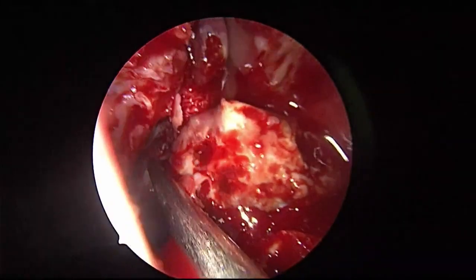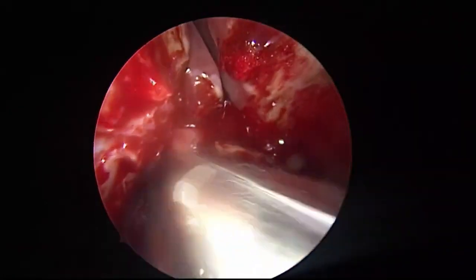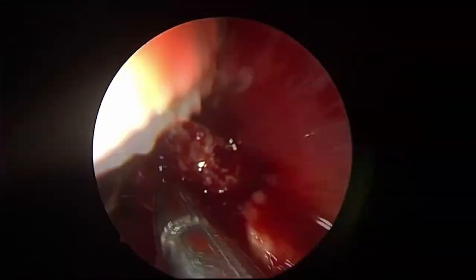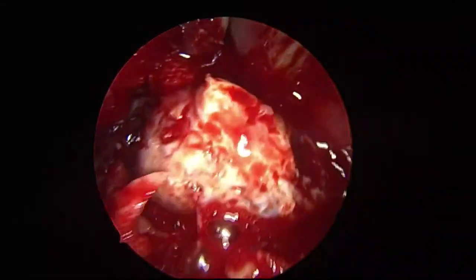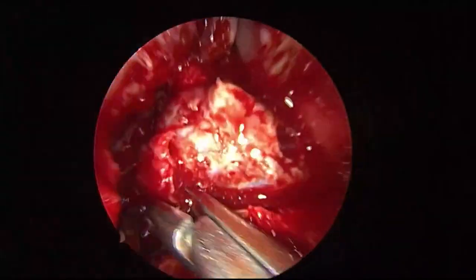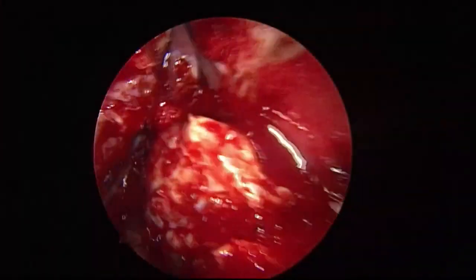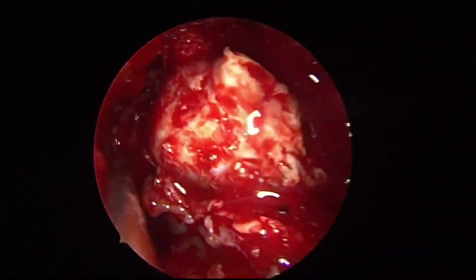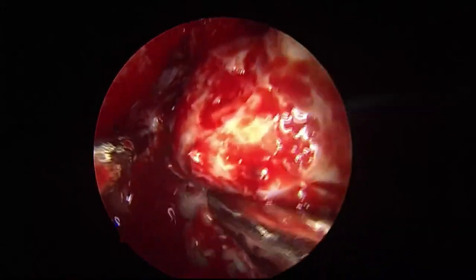See, I'm removing the lateral wall flush till the posterior wall. Superiorly, my limit is very clear: the orbital floor. This is all lateral wall being removed. This tumor has made difficulty by pushing anteriorly and pushing the lateral wall laterally. See this much, the access is narrowed.